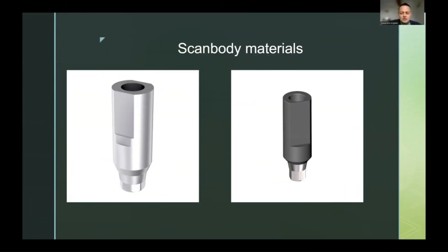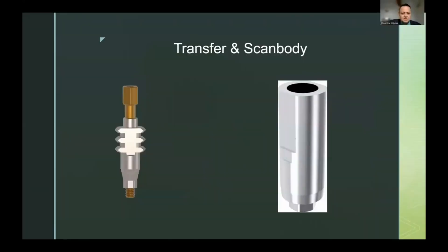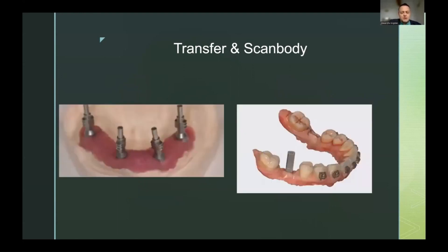Let's talk about scanbodies and what they are. Scanbodies are actually the equivalent of transfers, which were used in analog workflows to take the information of implant placement to the stone model. Inside them, an analog is screwed in and the model is poured.